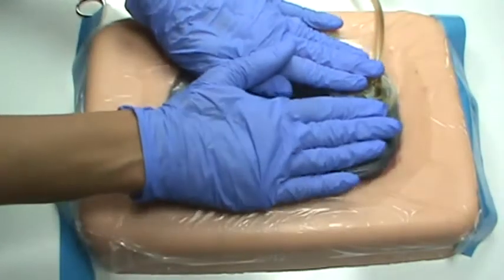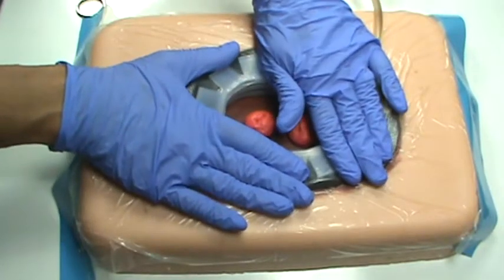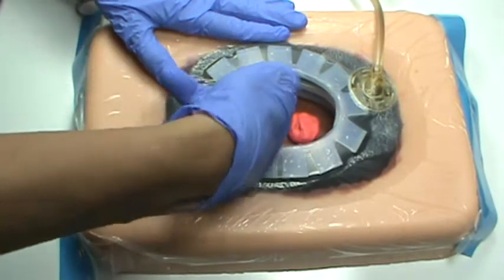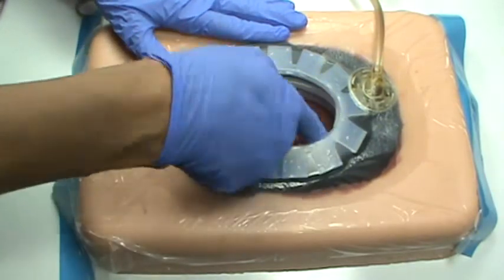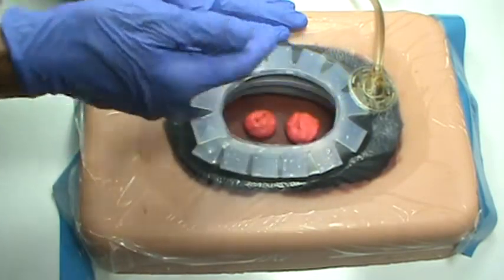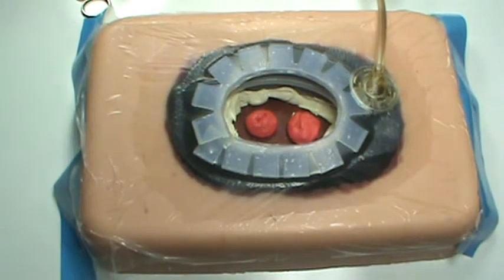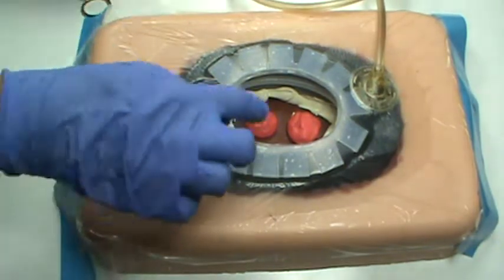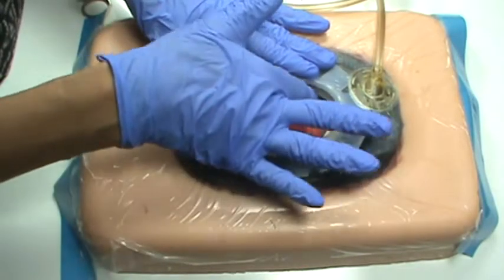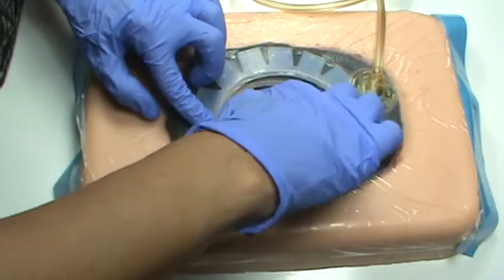And at this point, if you have a hard time getting a seal, I take and add a ring of stoma paste just along the inside, like that. Once the stoma paste has been applied, I usually will gently work it with my fingers until I get a seal.